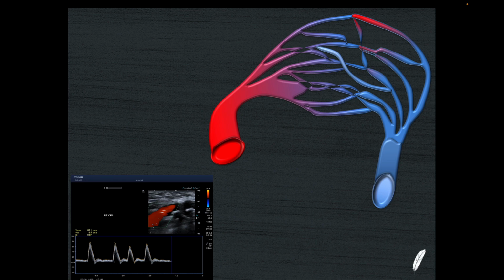The second part of the waveform, the diastolic component, is governed primarily by the capillary bed. If you have a capillary bed like in a muscular system like this one, which is a tangle of really tiny little vessels, then it provides quite a lot of resistance to flow coming through it. So when the left ventricle beats, the blood rushes through this arterial system, but it ends up in this myriad of tiny little vessels, and so there's a lot of resistance as the blood tries to push its way through it, and then eventually it gets into the venous side and empties out into the venous return system here. And that's the type of waveform you expect with something like a femoral artery or an external carotid artery, etc.